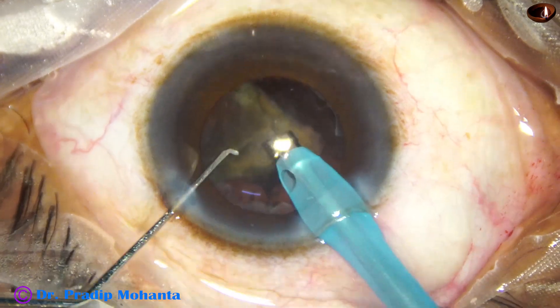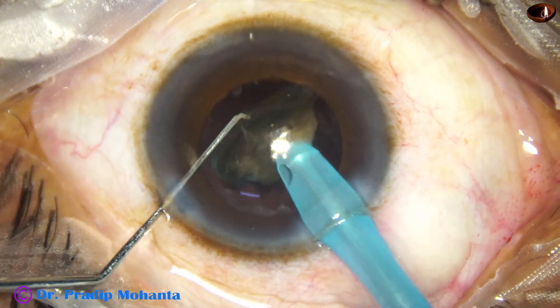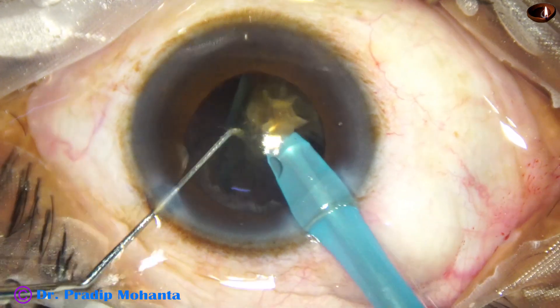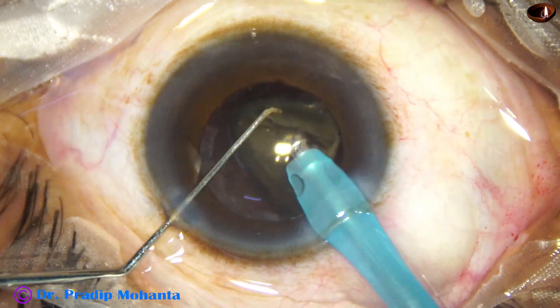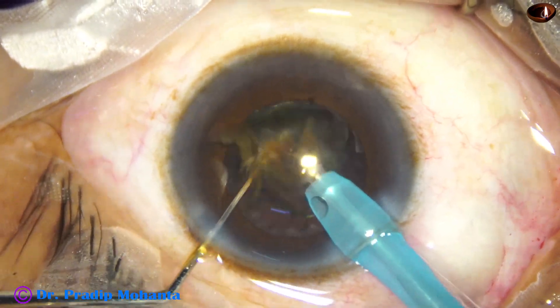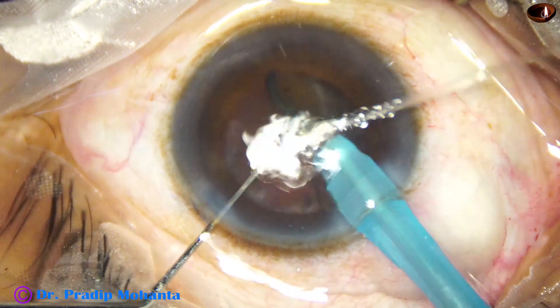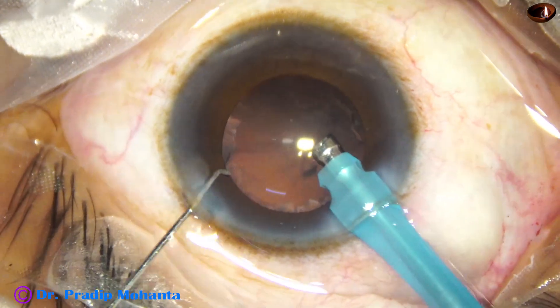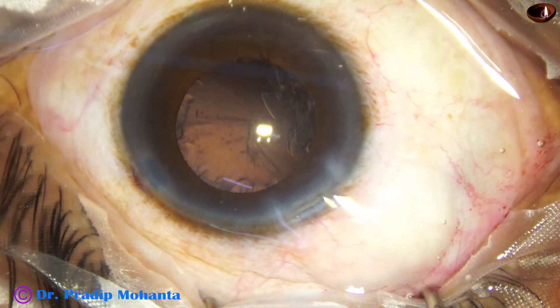Care is taken to maintain the anterior chamber depth at all times. This is the last piece. At this time, I detach the epi-nucleus and use it as a contact lens to protect the posterior capsule — the epi-nuclear shell has been detached and it is protecting the posterior capsule. Once the nucleus is removed, with a lower vacuum of about 400 millimeters of mercury, this epi-nuclear shell is removed.